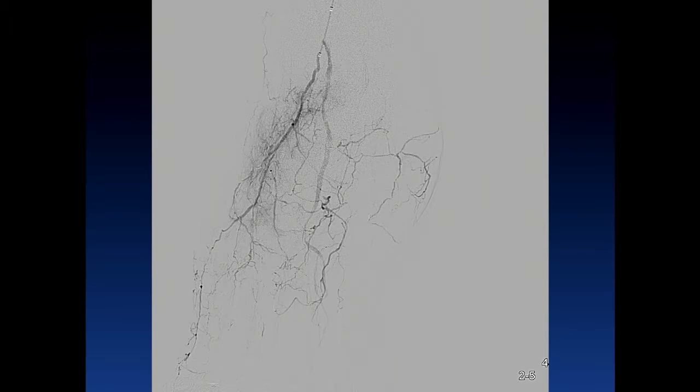and had the wire fairly straight with the tip for a while, looped it towards the distal end, and re-entered pretty easily. So you'll have to take my word for it, but there was no major funny business getting the wire down in the first place, and it crossed within just 5 minutes. So I did a hand injection to verify that we were true lumen. Was pretty happy with this. Looked like it was going to be one of the easier limb salvage cases.